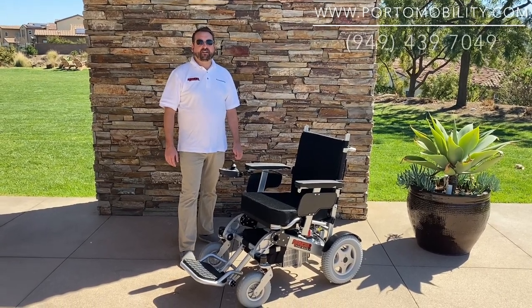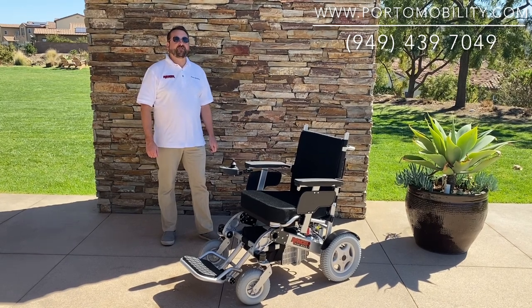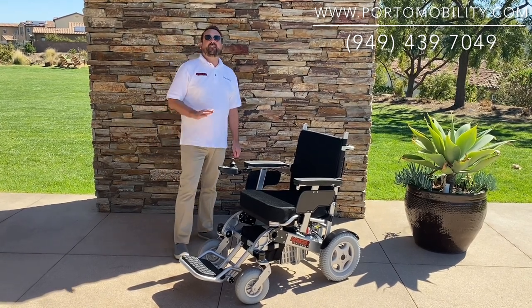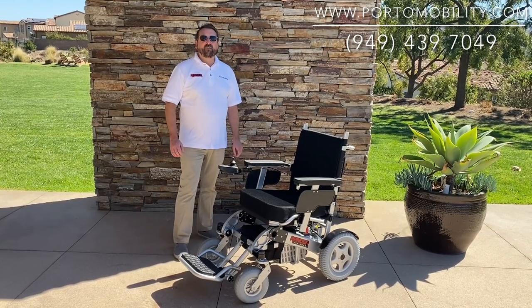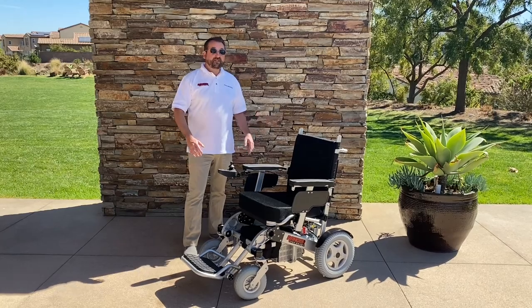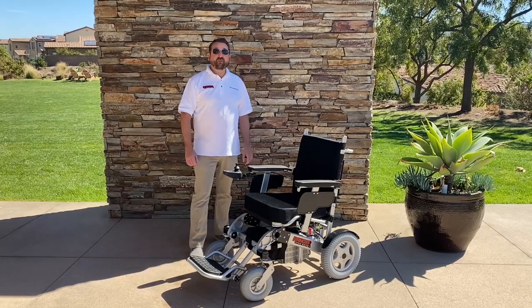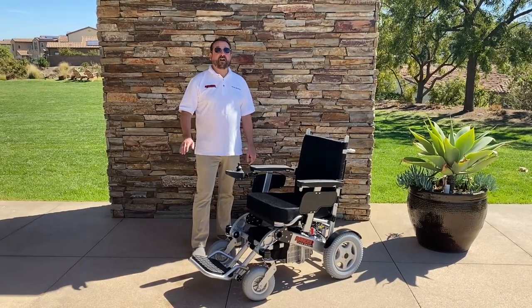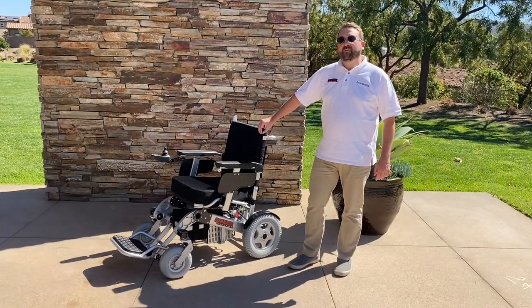Hello, I'm Mark with Porto Mobility. Today we're going to be going over the Ranger, the Beast version. This chair is a lot different than any other chairs on the market in that it's the SUV of the other foldable power wheelchairs. The Beast is the most sturdy of all the Ranger series. It's also the most comfortable and gives you the smoothest ride possible due to all the advanced features. Now I'm going to show you some of those advanced features.